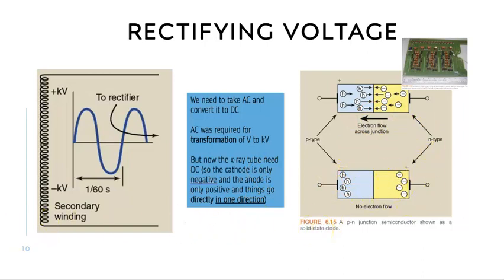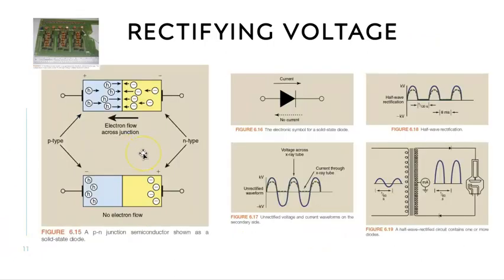If you recall, a semiconductor is something that in a certain environment will conduct electricity, and when that environment's not quite right, it acts as an insulator, which does not conduct electricity. That's exactly what this semiconductor is doing. And it shows you a little image here of the actual rectifier bank.